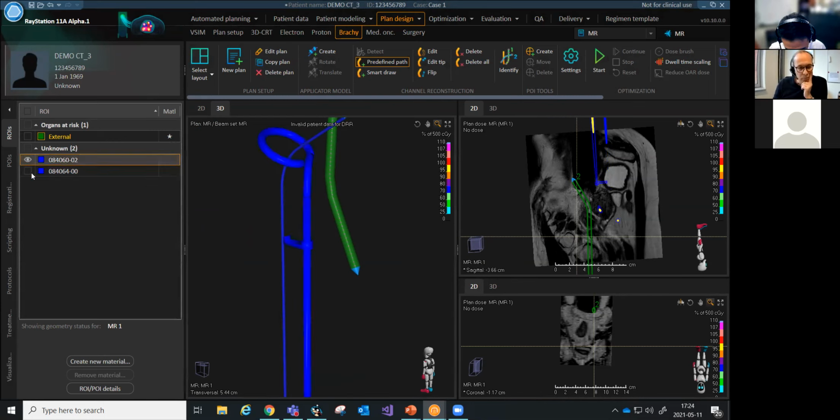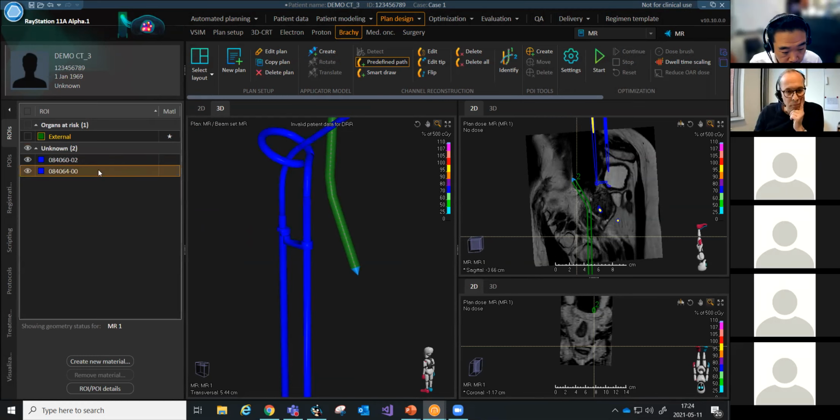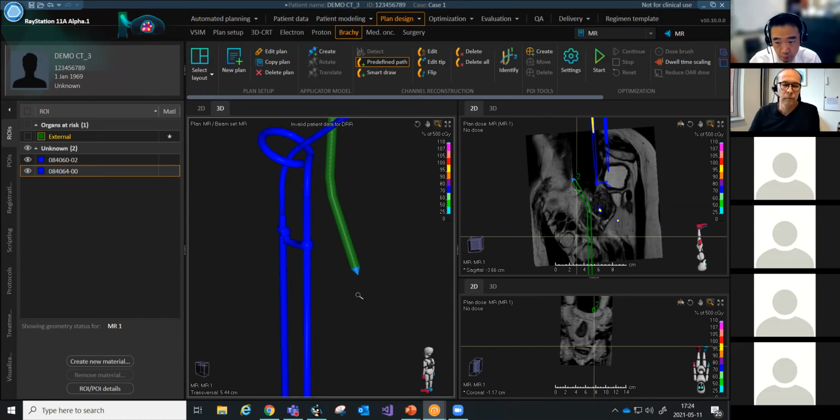And there are generic formats for how you represent a surface like this. So with some scripting, it should be possible to get applicator models that are given as an XML file or an open format like that. Okay, thank you. Nice. Thank you.